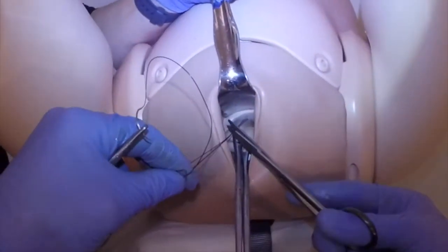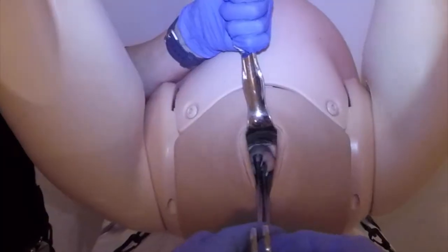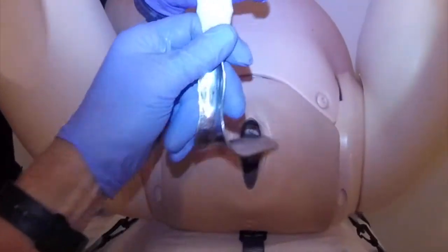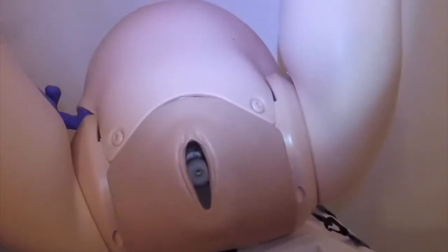I don't tie a loop anymore. I've had a few patients where the woman has come in as an emergency and the people have only cut the loop and haven't actually removed the suture. At this point we're going to do an in-and-out catheter to check there's no blood in the urine, and if not, the woman will go home later on the same day.